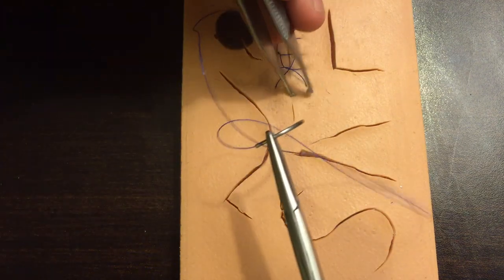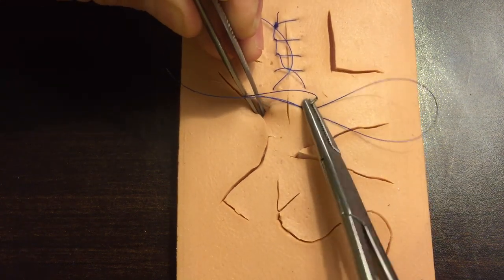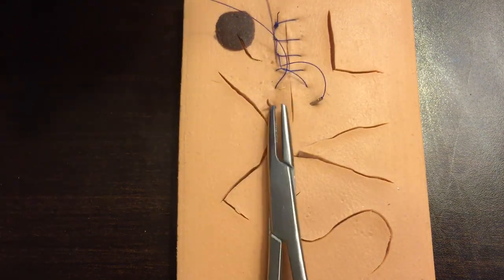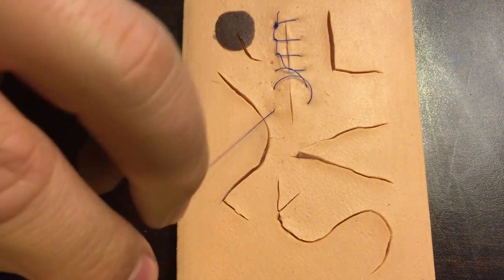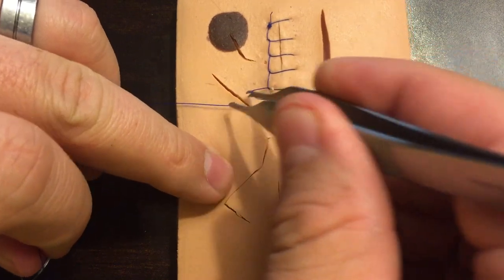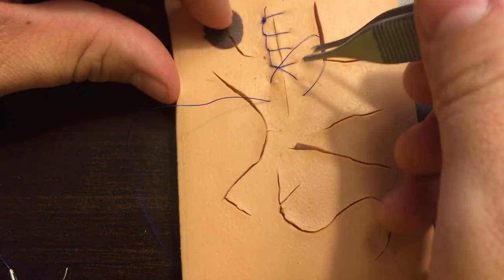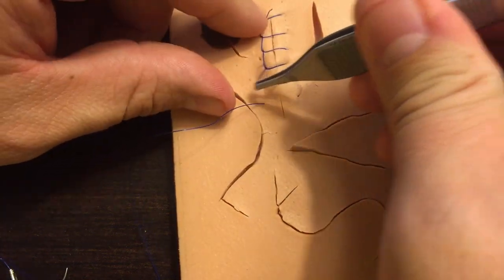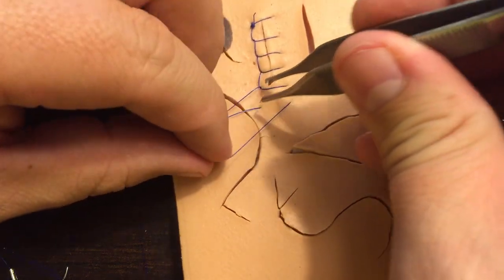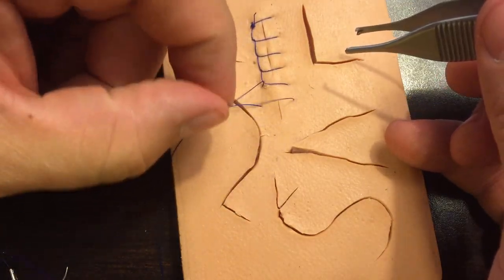So when we tie for this last throw, we're not going to bring our needle up through the loop. We're going to bring it up outside of the loop. So not in the loop, outside of the loop. So as we do that, you're going to see that across, we're still going to get that locking mechanism from above. But see this, don't pull it all the way tight and you'll see it now. Then with your patient, before you tie this, you want to make sure everything else above it looks nice and snug. So I'm going to pull back a little bit here. You want to work it a little bit with your pickup, make sure everything looks snug, make sure everything's lined up and that it's all going to heal well.